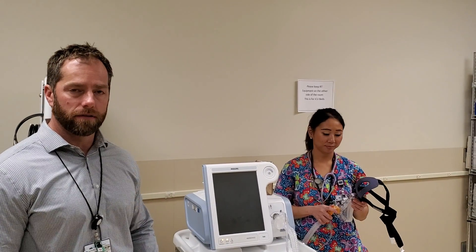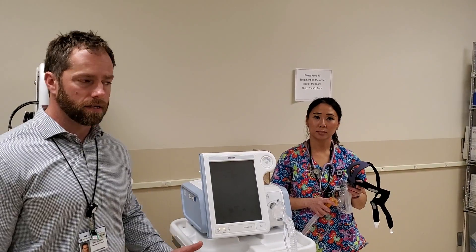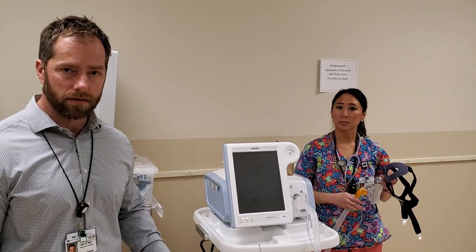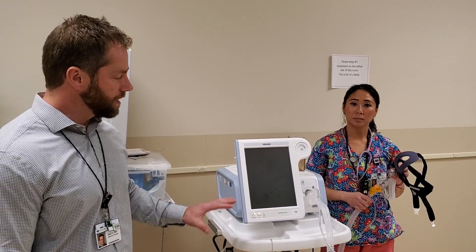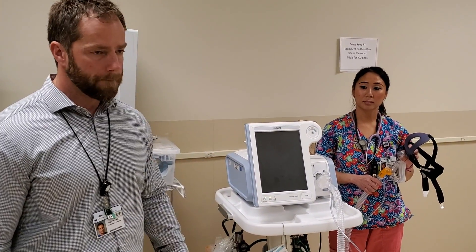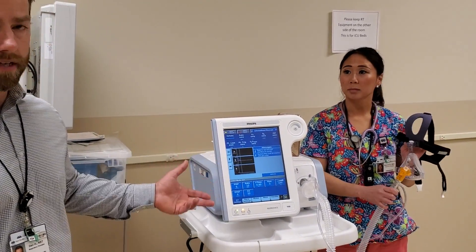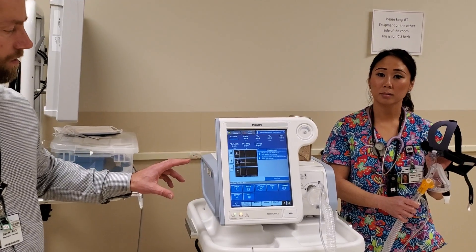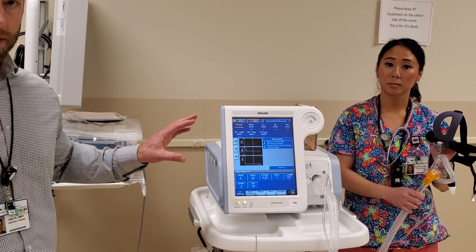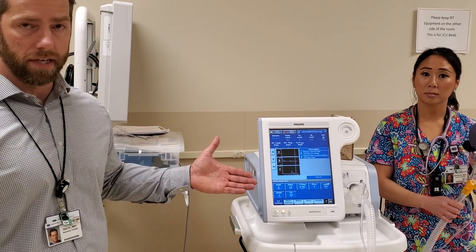This is a brief video to demonstrate BiPAP use for nurses on medical floors in the hospital. We're going to start by turning the machine on. When the machine is turned on, whatever settings were in it previously are saved, so if this was on your patient you can feel comfortable just turning it on and putting it on. We turned it on and it's ready to be placed on the patient.